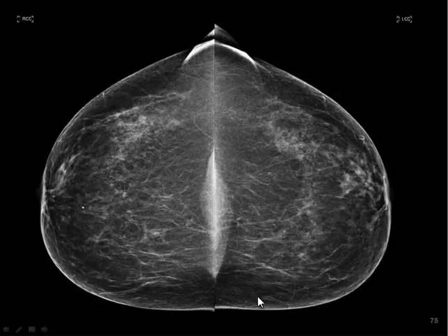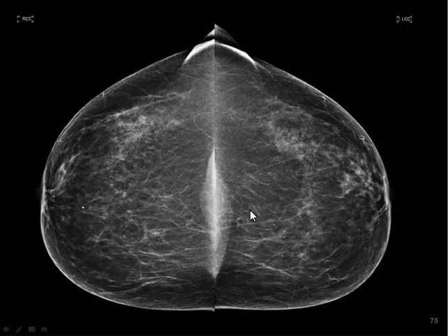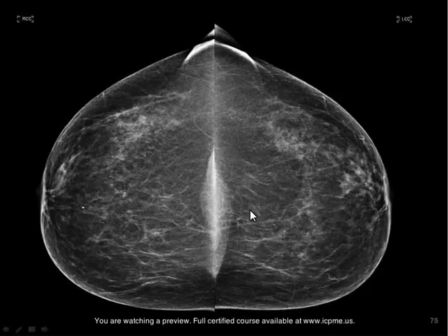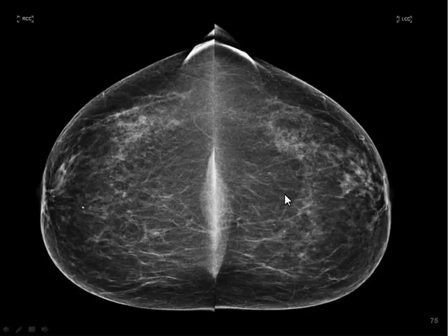Here we go with another relatively fatty replaced breast, and this is an interesting story. This is a teacher who was supposed to come in February for her mammogram, but she had some personal issues and couldn't come until May. If she had come in February, we wouldn't have had tomosynthesis, and she probably would have been called negative — and actually in our research study was read as negative.